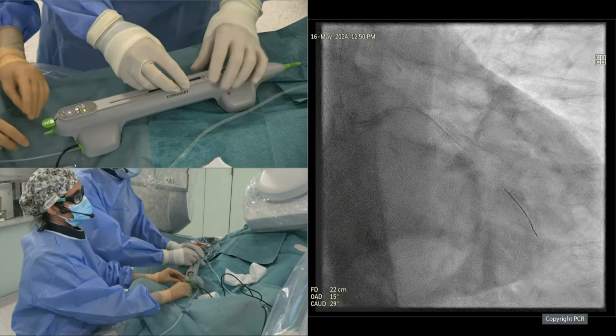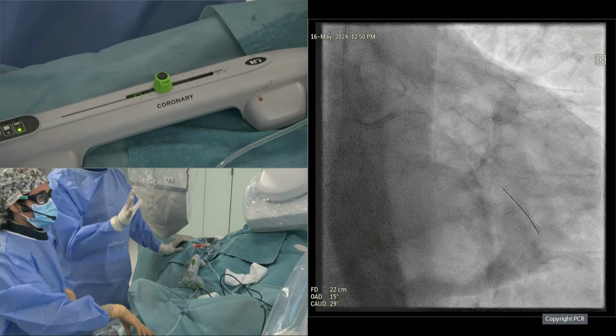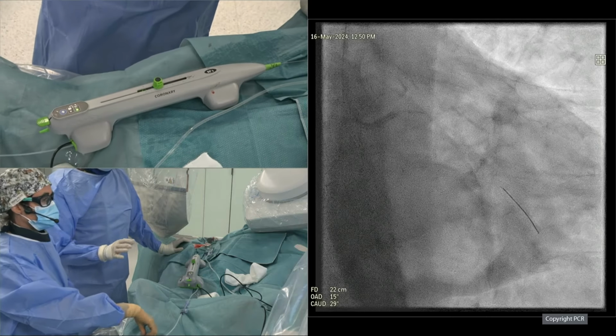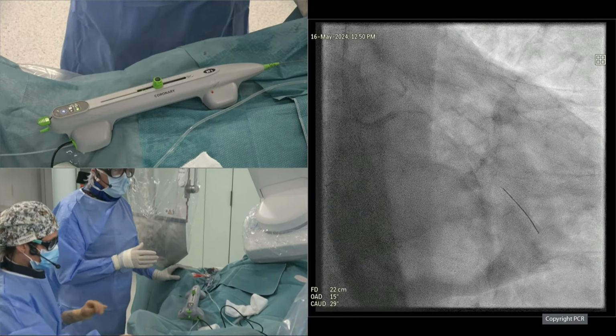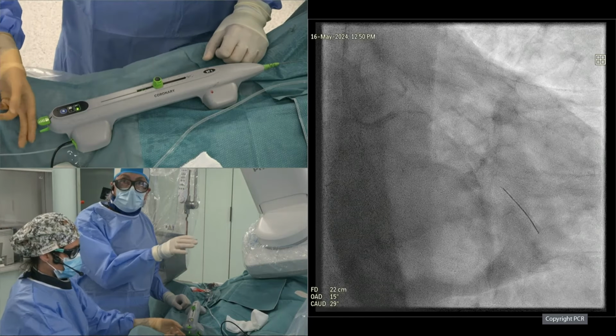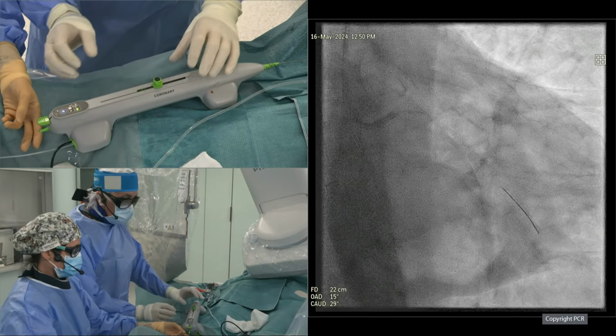Okay, happy with that. And probably, Nieves, a third. In this particular situation, I would not go to 120,000. I think I will stick to 80,000. I think that's probably the best. The patient is doing very well. The hemodynamics, we can see the EKG is perfect. The patient is not having symptoms. Again, we go to glide assist.